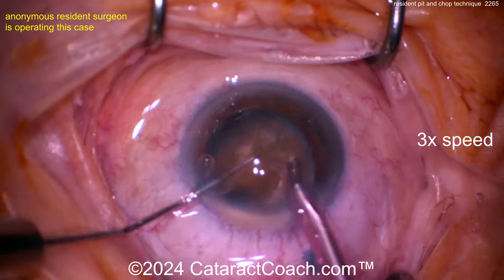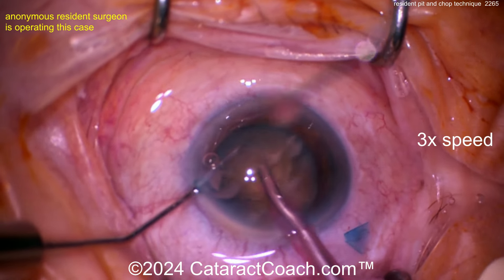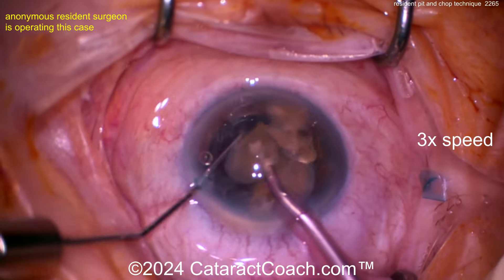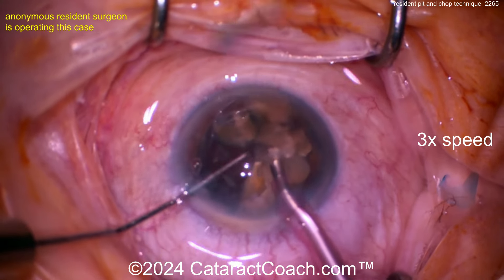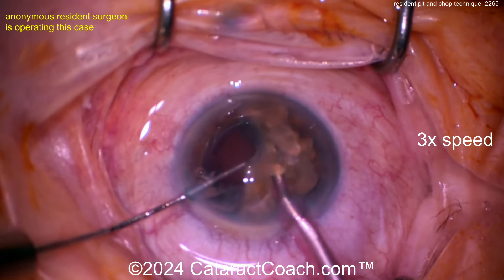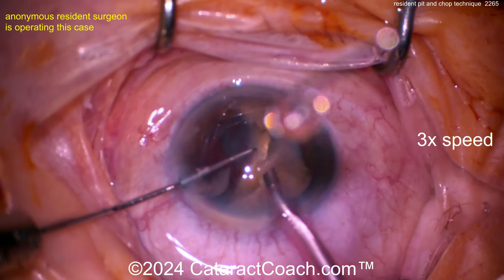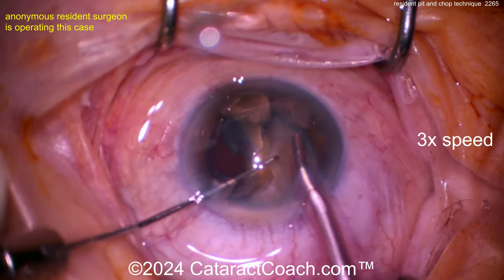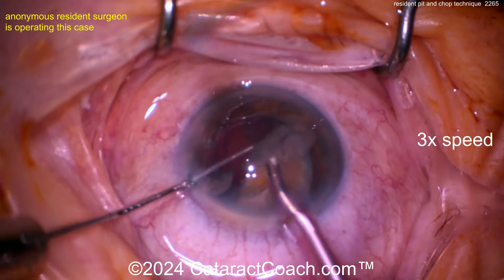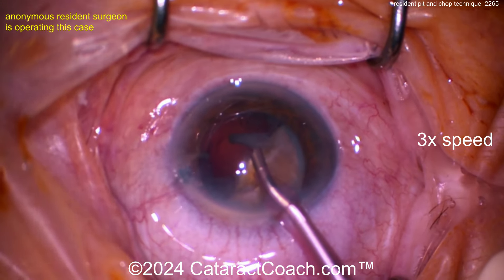This looks really good. You can see the squirt bottle cannula that keeps blocking our view — that's probably the attending or professor giving some advice. Very nicely done, young surgeon. I just wish the attending wouldn't keep blocking your view. Now taking out these first chunks — beautiful chop technique. Notice how the eye stays in primary position, the draping is good, no eyelashes touching the cornea.